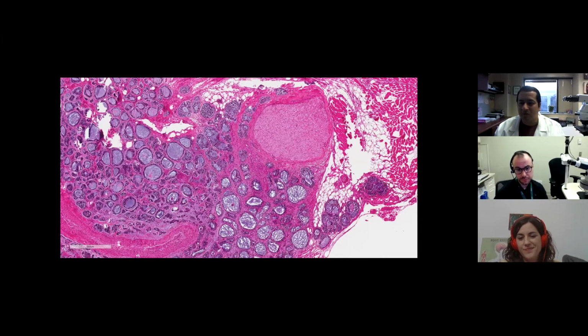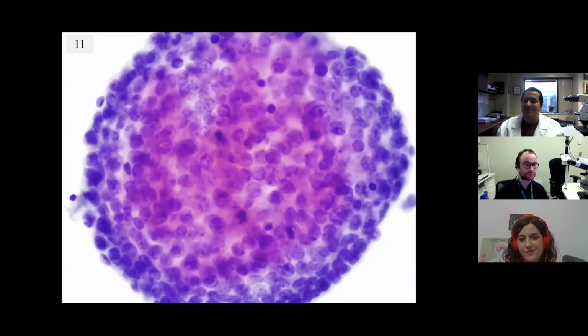mucoepidermoid carcinoma. All right, let's do another cytology case. He wants to kill us today. I know. He said, have you paid attention to my correlation session in USCAP or not?